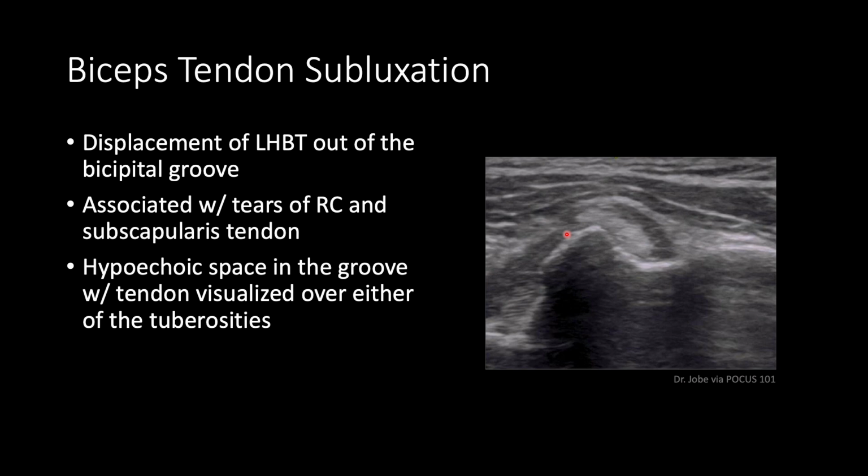Usually this pulls the tendon medially, and this can be subclassified further based on its location and the mechanism of injury for the involved structures, but I don't expect you to know those details. We'll save that for our sports medicine fellows. However, being able to recognize a subluxation or a dislocation may come in handy if you have a patient with joint instability and weakness.